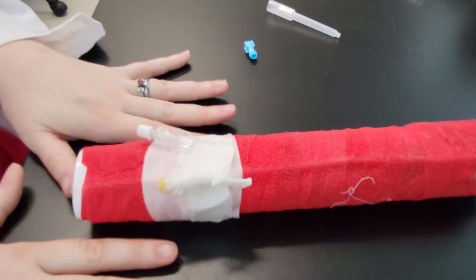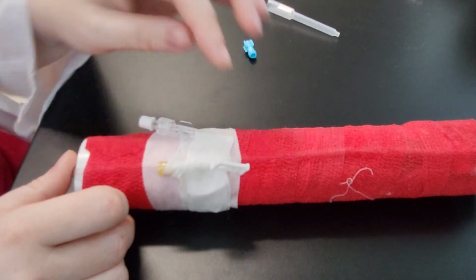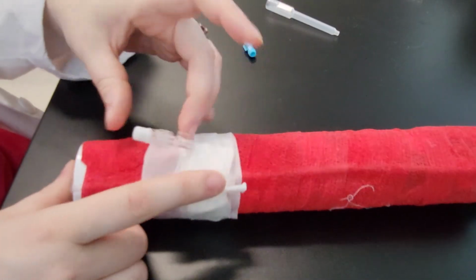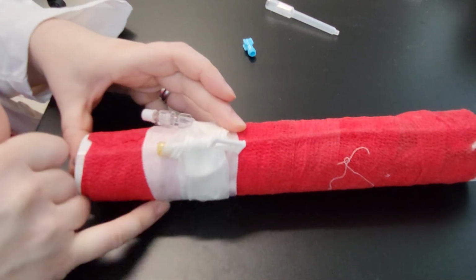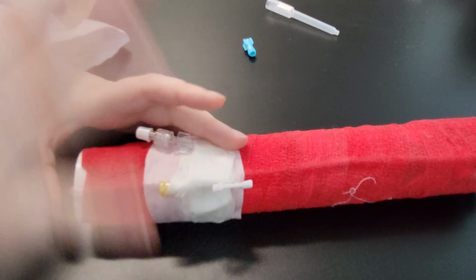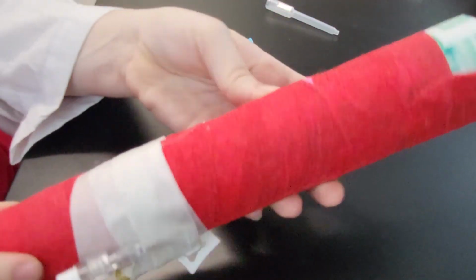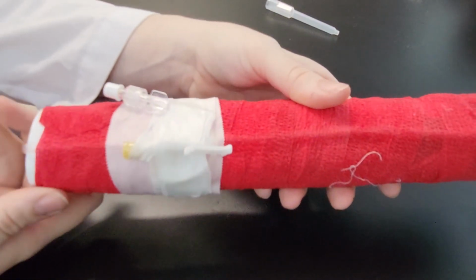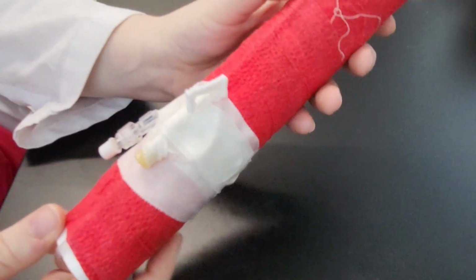This is how your finished IV catheter should look. 5 pieces of tape. Your T-port is nice and available on all sides. Your injection port is covered, so there's less of a chance of inadvertent bacteria introducing into the area. And the bottom may not look as pretty as the top, but that is totally fine, as long as it's patent and our patient can get everything it needs.